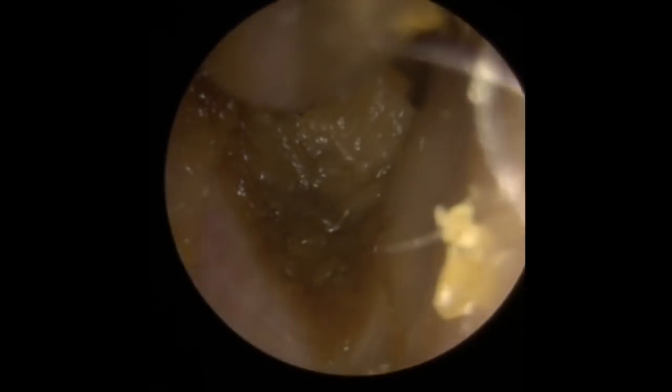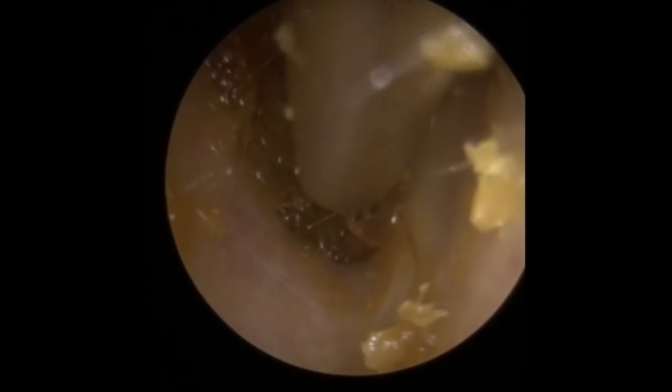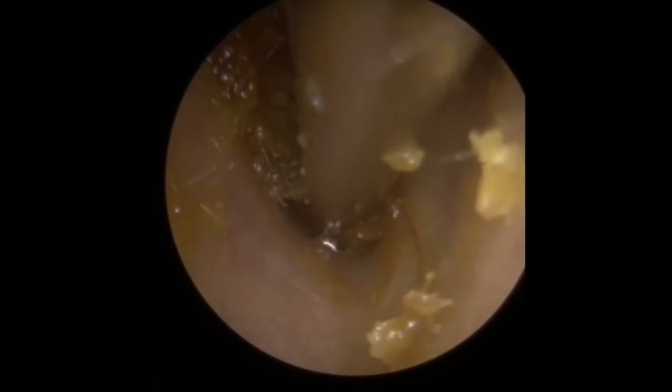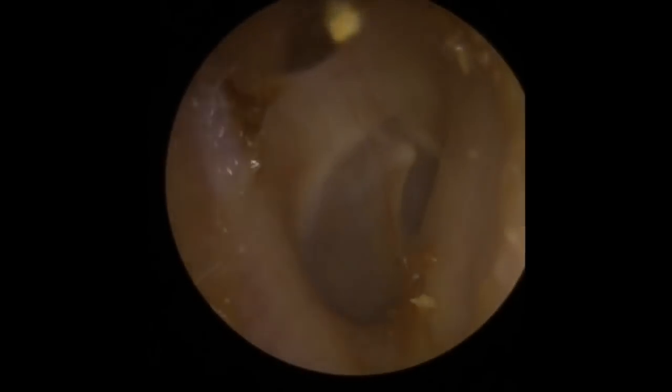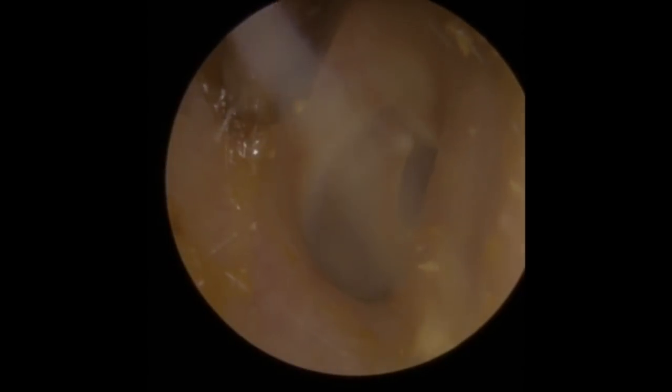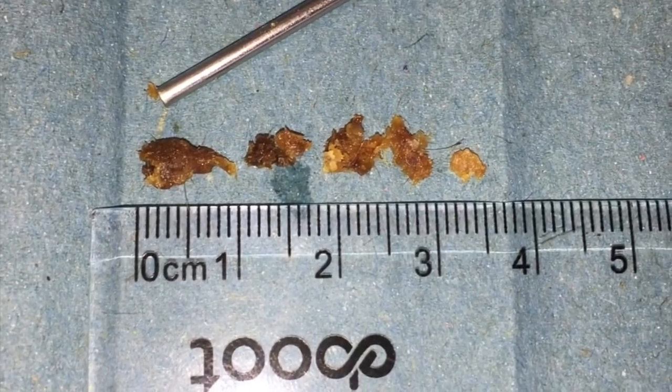Little bits of dry skin and drier bits of wax getting sucked in. Now we're going to work on the deeper section of earwax, aiming for the bottom. Because this is in a slight groove, if we can aim for the bottom we might be able to lift it out. So we broke the seal at the bottom of the canal wall and then took this big chunk away. A little tiny bit there to the left hand side — so I'll hoover that up. Bit of tidying up. And you can see the eardrum there looking nice and healthy.